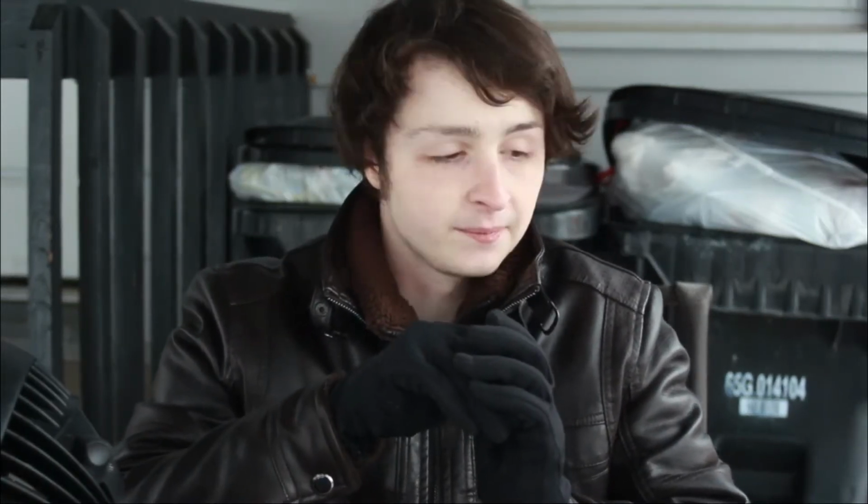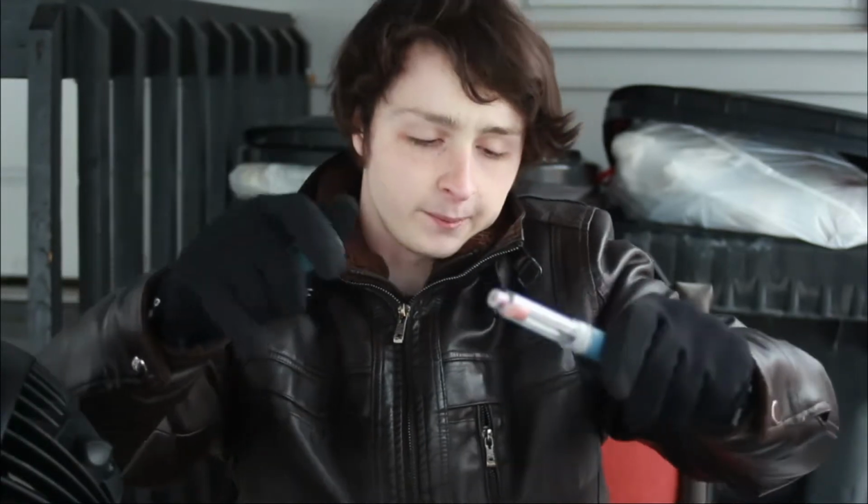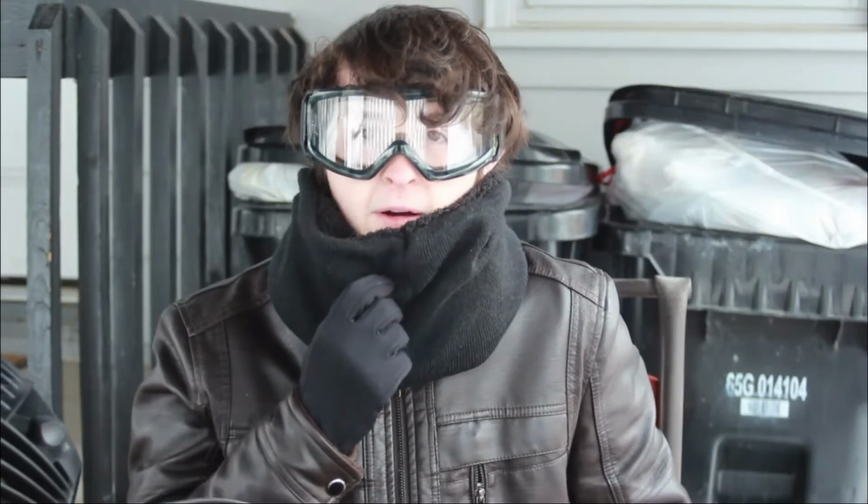Now to start, what we need is safety, because this part is using a hot knife to cut through around here in order to get the vial out. There's going to be plastic fumes, so obviously we're going to need safety goggles. We're going to need something to block the mouth so you don't breathe in any smoke, and we also got this fan right here in order to get rid of any fumes. So let me get this safety gear on and we'll zoom in on the work and we'll get back to you. Alright boys, we're back.